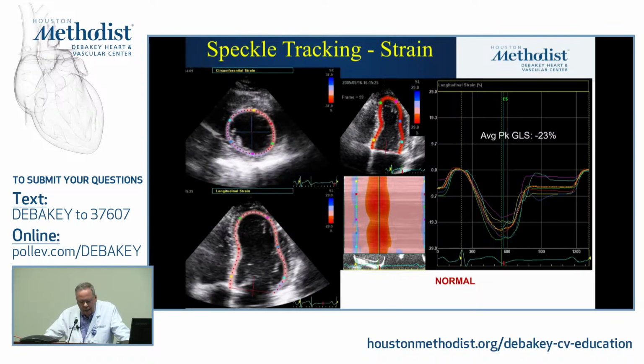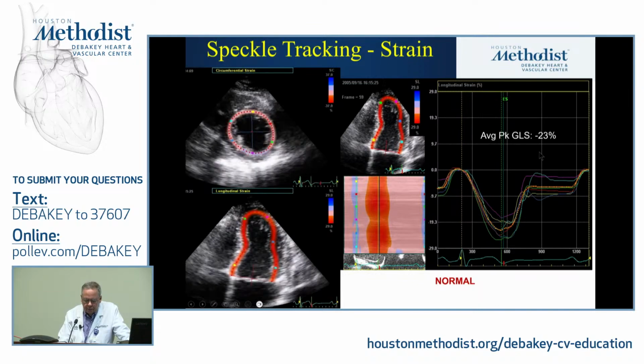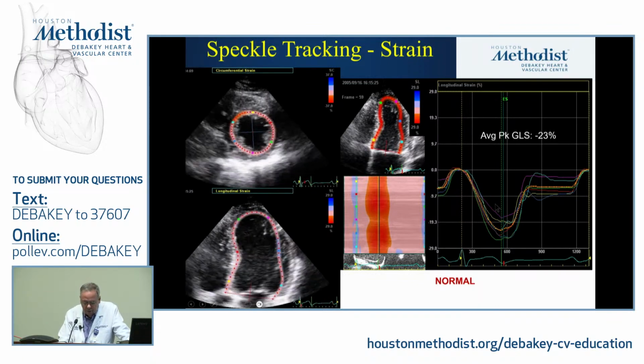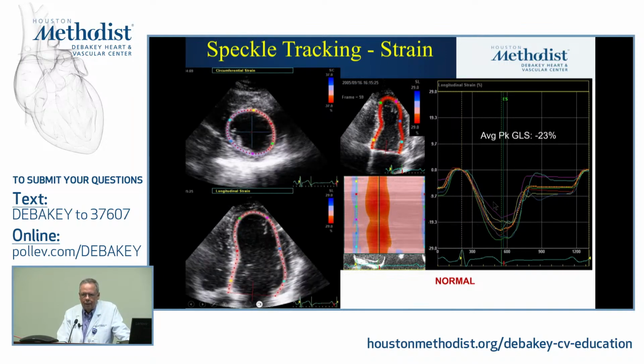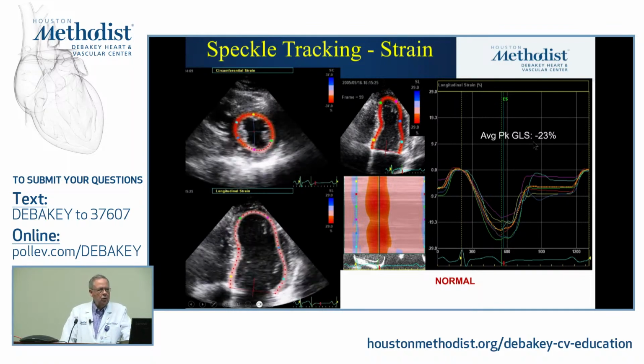Okay, so the same thing happens here. People have put in a minus sign, but it creates confusion because a minus 14 would be considered better because it's more positive, but of course, from a function point of view, it's not. So let's just drop that, right, and talk about absolute values.